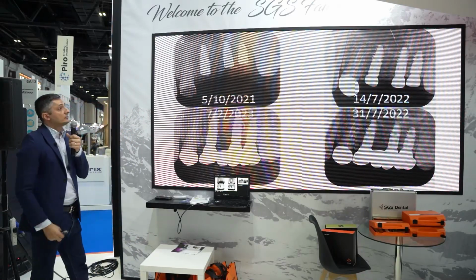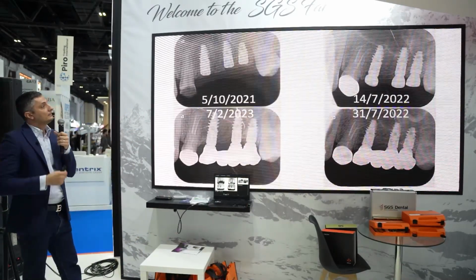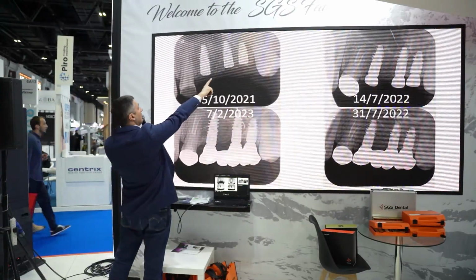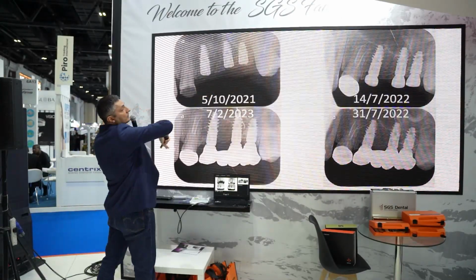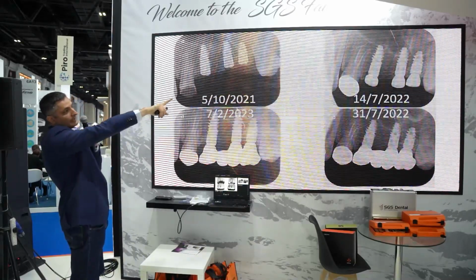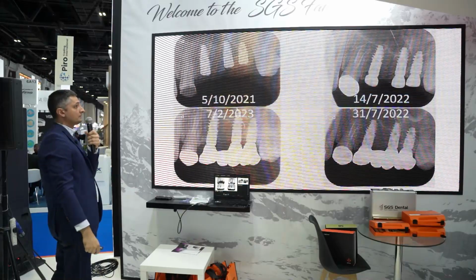Okay, I caught this patient yesterday. He came with these 3 implants. On this one I did a guided bone regeneration. We can see the difference in the texture of the bone on the last implant. This is a grafted implant.